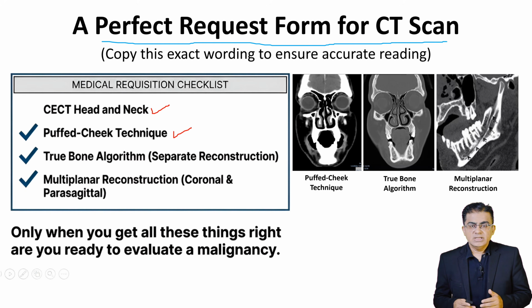Third, you explicitly ask for a true bone algorithm. And note that this must be a separate reconstruction. It is not just adjusting the bone window on the viewing console. You need that dedicated high spatial resolution to catch early cortical erosion.